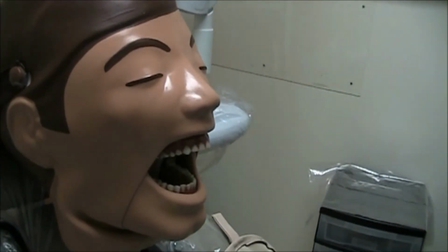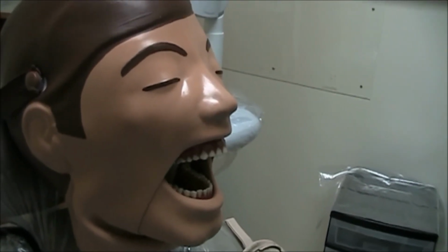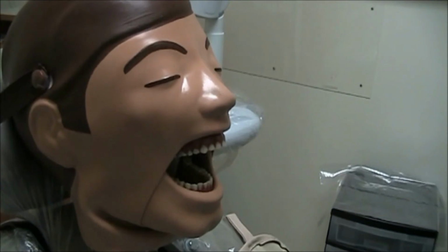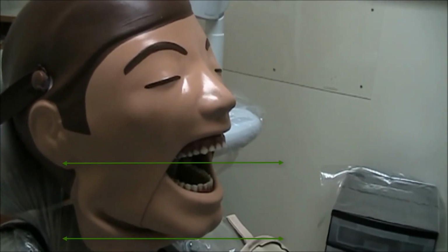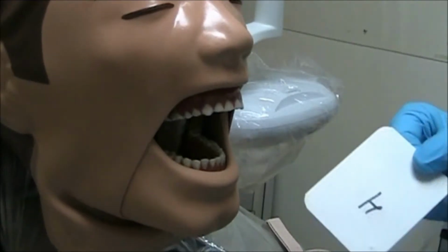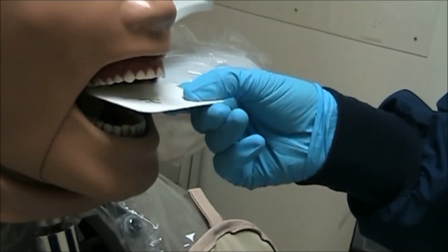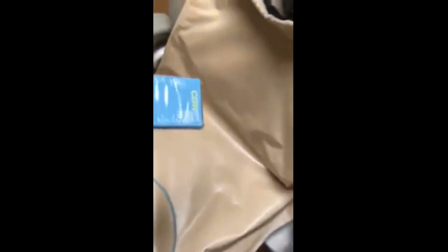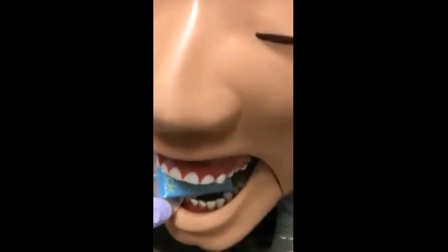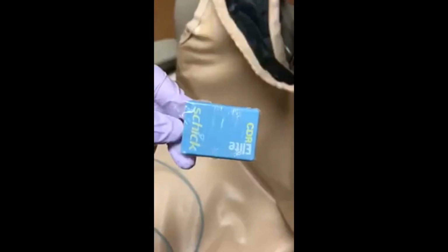When we are exposing maxillary topographic occlusal projections, we have to make sure that the patient is positioned such that the maxillary arch is parallel to the floor. Technically, size 4 film is recommended for this type of exposure. In our clinic, we will use size 2 receptor with a flat side of the receptor facing the maxilla and the long edge in a side-to-side direction.